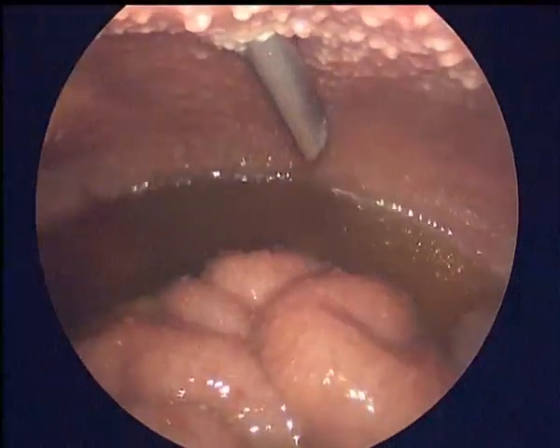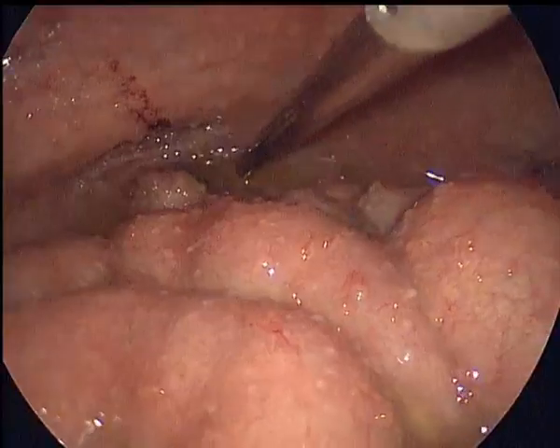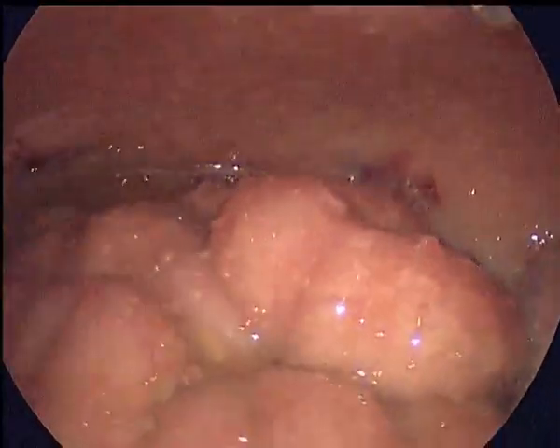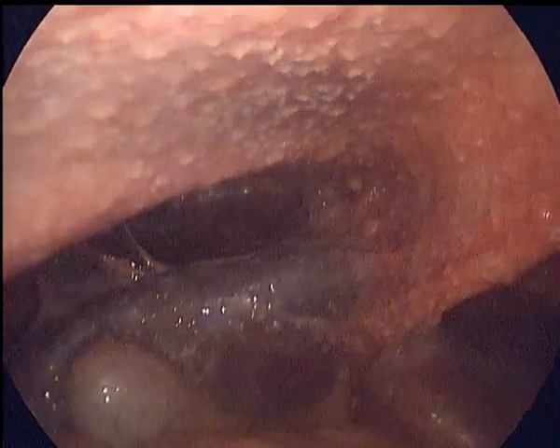This is an interesting diagnostic laparoscopy. A young lady, 30 years, presented with us with ascites, tumor marker raised. So we proceeded with diagnostic laparoscopy. We found huge ascites and multiple peritoneal deposits over the small bowel, over the large bowel, all over the peritoneum.